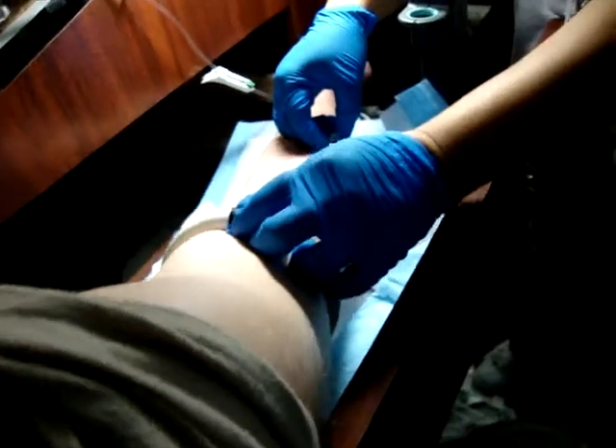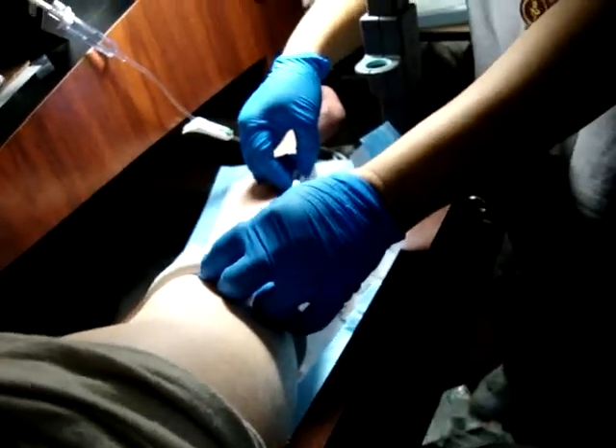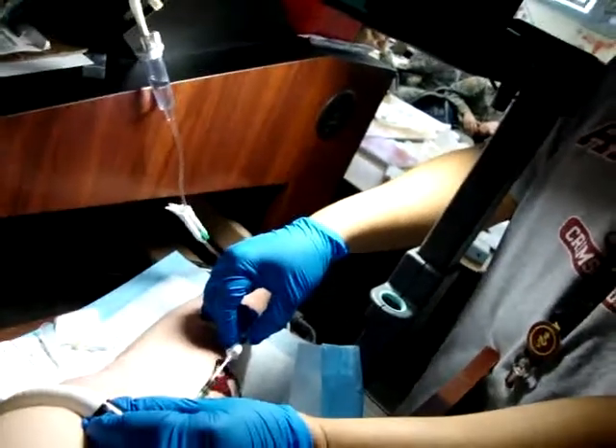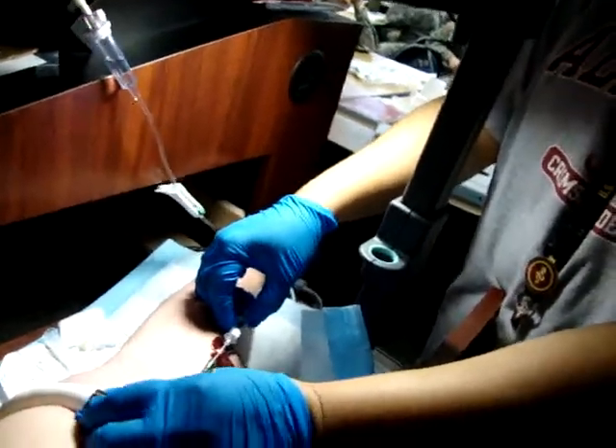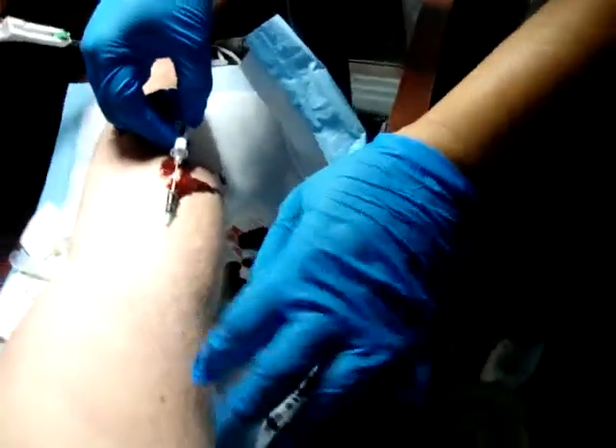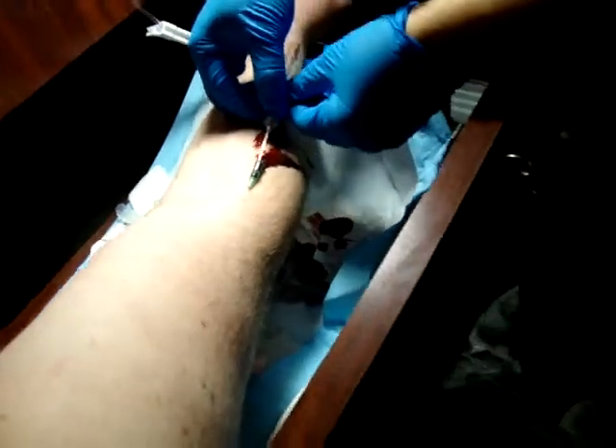Do it! See? See how it's gushing? Oh my God! Wow! And this is what happens when you take it out and you forget to put pressure above the catheter site.